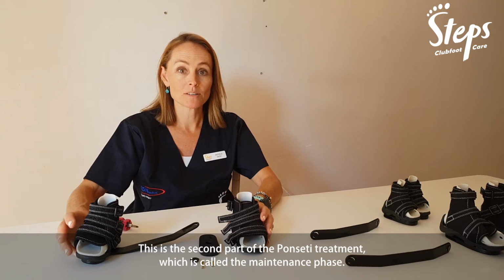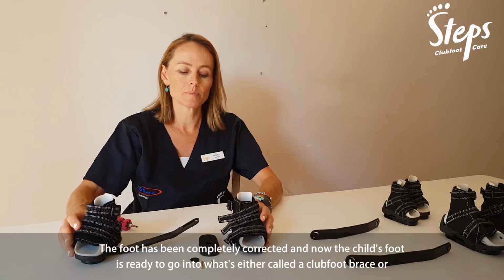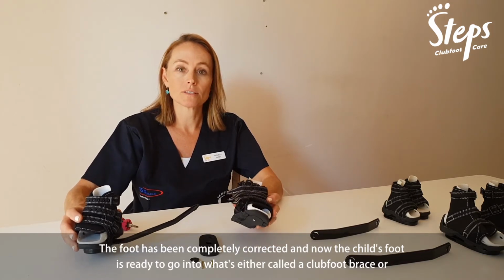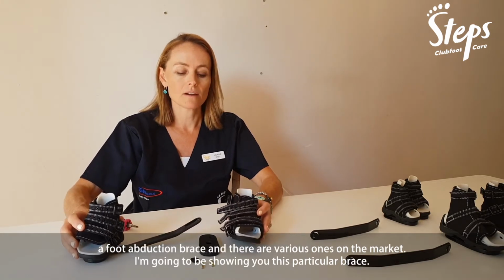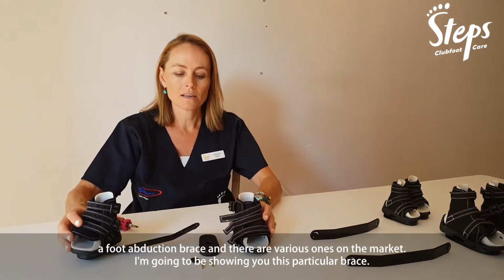This is the second part of the Ponseti treatment, which is called the maintenance phase. The foot has been completely corrected, and now the child's foot is ready to go into what's either called a clubfoot brace, a foot abduction brace, and there are various ones on the market. I'm going to be showing you this particular brace.